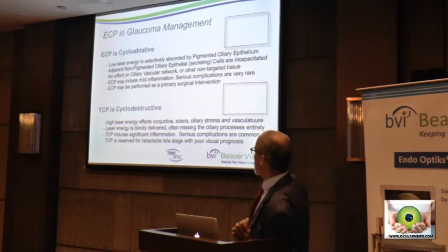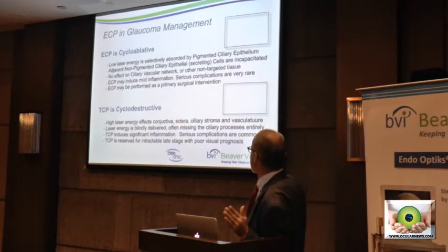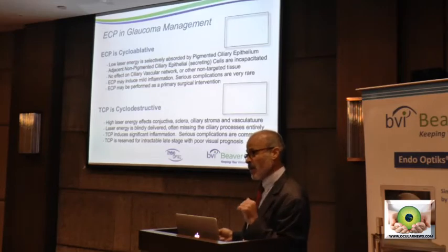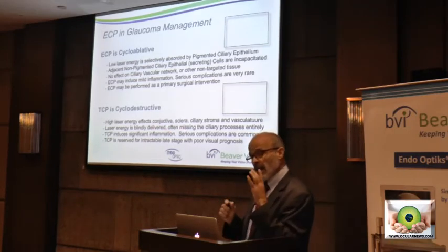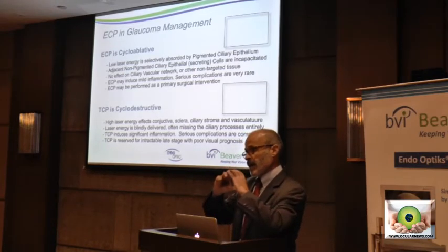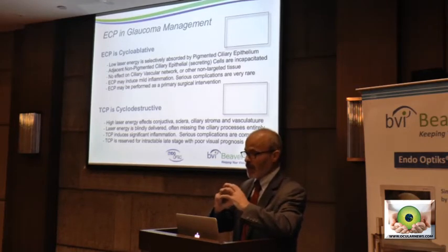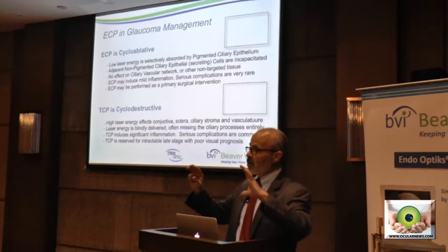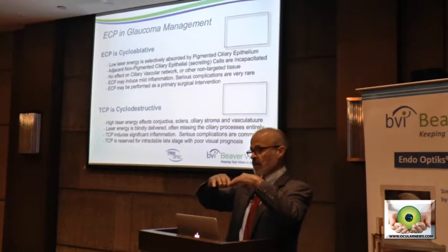TCP, by contrast, delivers energy affecting everything from the conjunctiva through the sclera, the ciliary stroma, the vasculature, often missing the target tissue entirely because you're blindly delivering this. I mentioned to Dr. Upshum that at the ESCRS last year, Professor Neuhann from Erlangen University showed 80 eyes endoscopically to show the enormous variation in the orientation of ciliary processes.